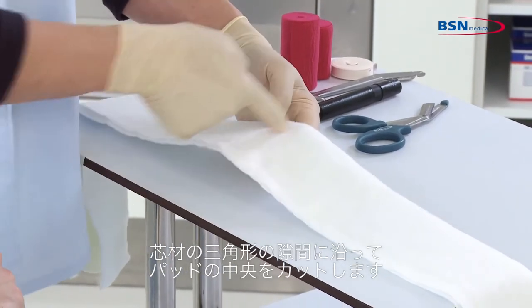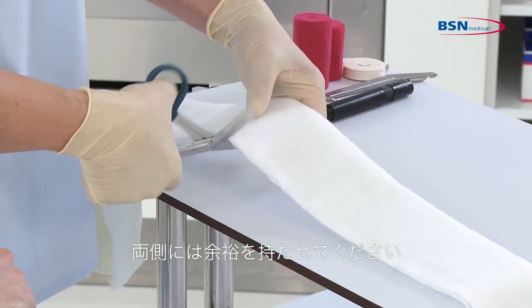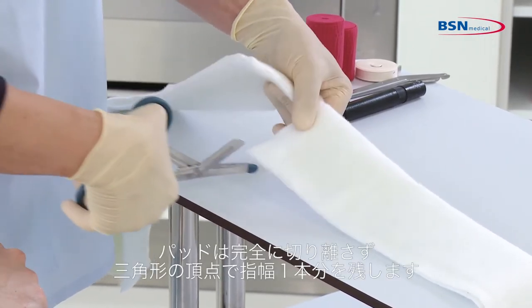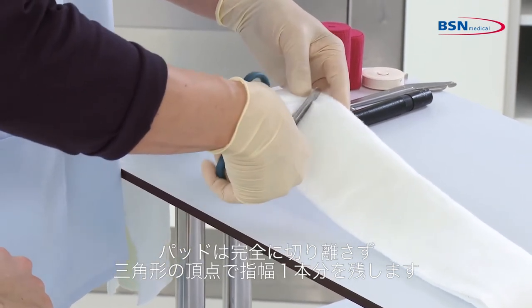Cut the padding in the middle, following the triangle shape of the substrate gap and leaving a margin of padding on either side. Do not cut the padding completely — leave one finger width of padding intact at the triangle tip.